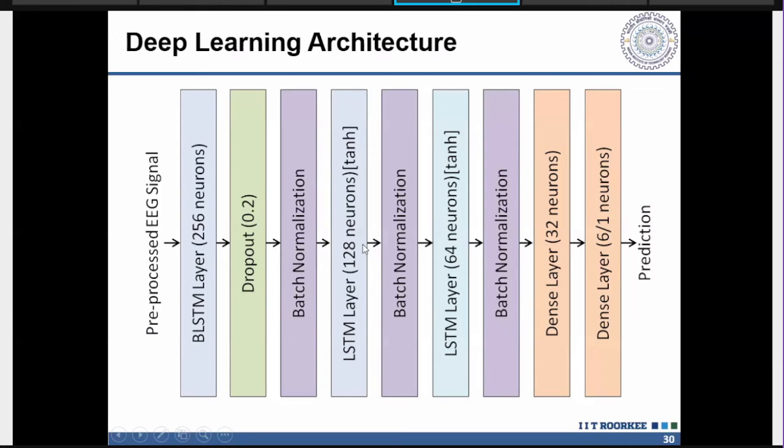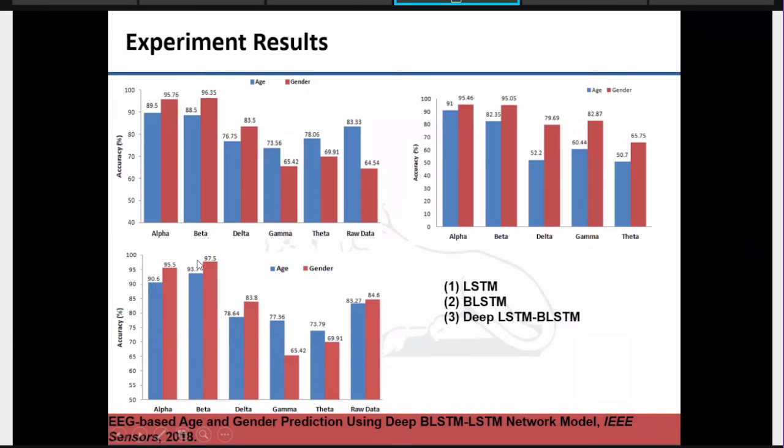So in this framework, we do not use any feature extraction steps. Just after pre-processing, we provide the signals and we get the classification.